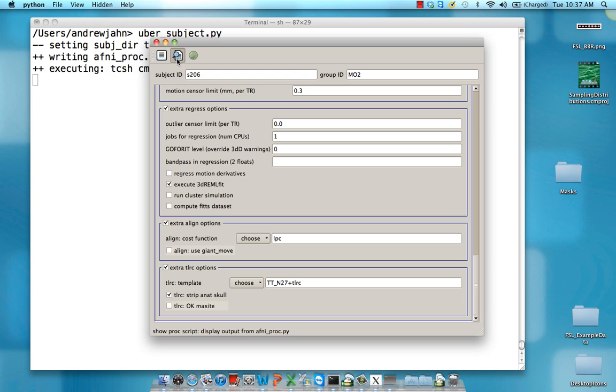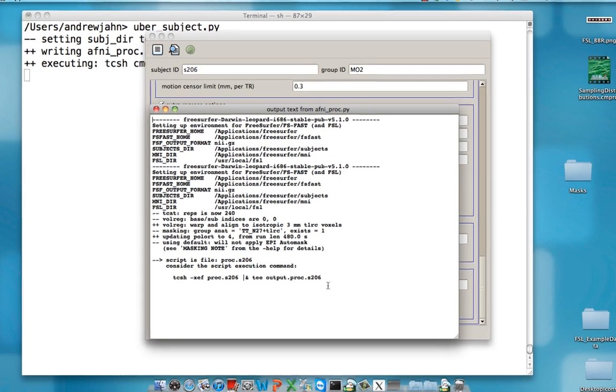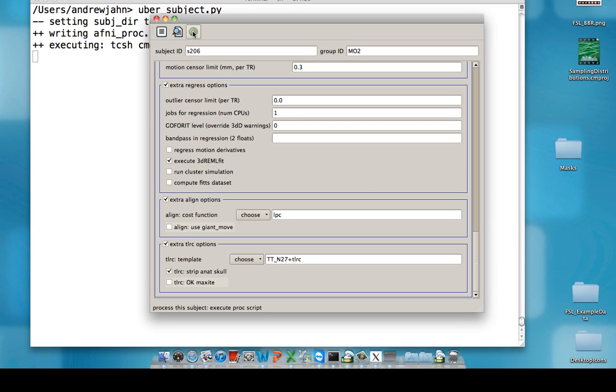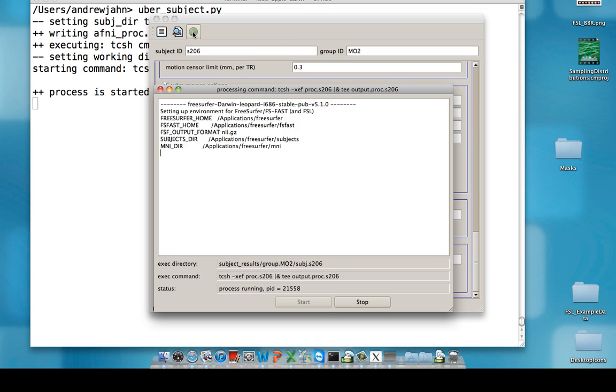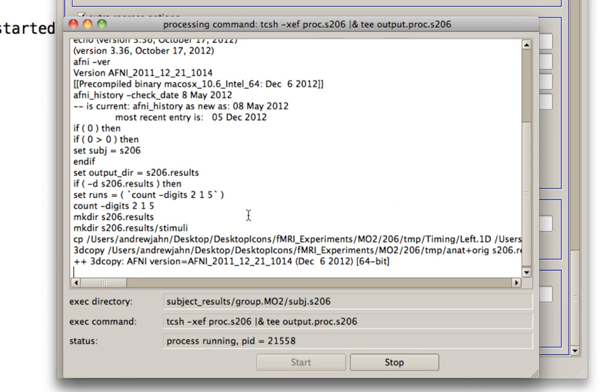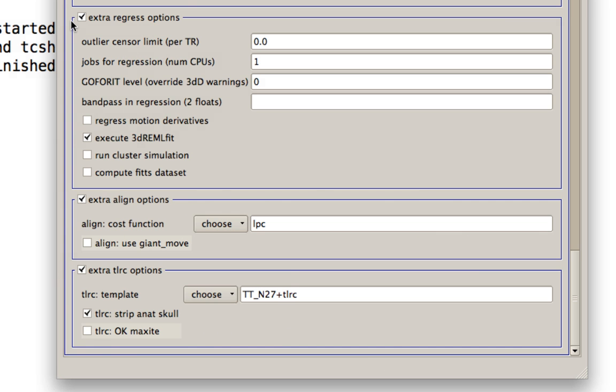Once that's done, click on this next button over here. This will show you the output from that command you just saw. Make sure there are no errors in this screen. It'll tell you, you can go ahead and run this if you wish to. Else, you can go ahead, close this and click on the screen button to actually run the procedure. You'll see all the output spit out this screen right here. You can stop it and it'll say that it failed. Process finished failure. But that's okay.